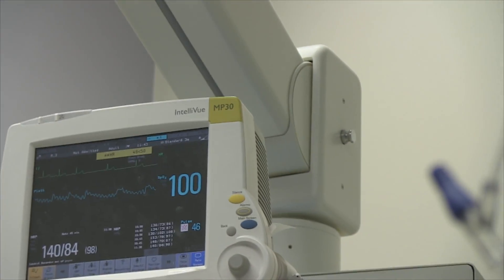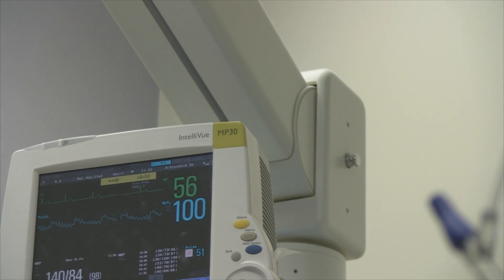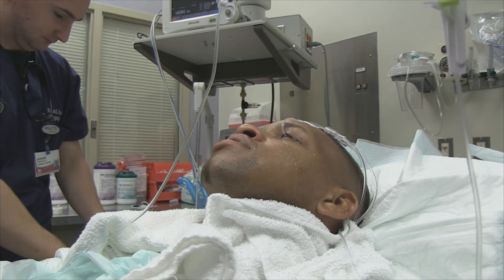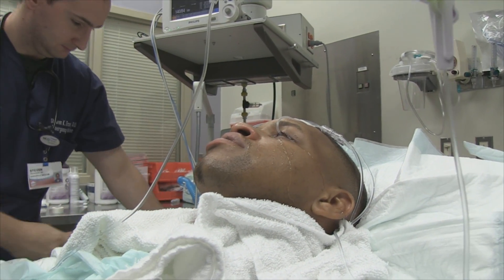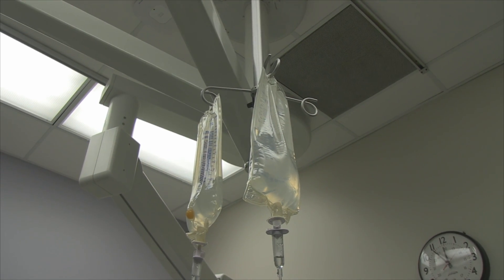There might be just a little bit of a vagal response from the eye pressure — that can slow the heart rate. His heart rate has actually slowed down significantly. As soon as these bags are done we'll get them out and get you up to see the ophthalmologist.